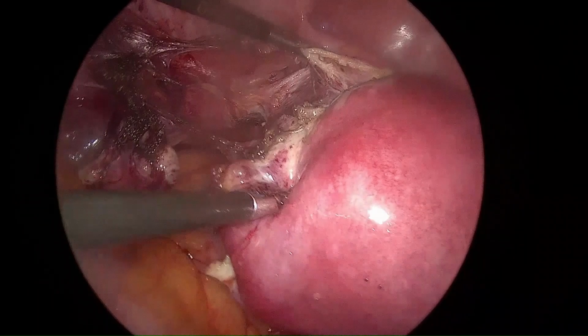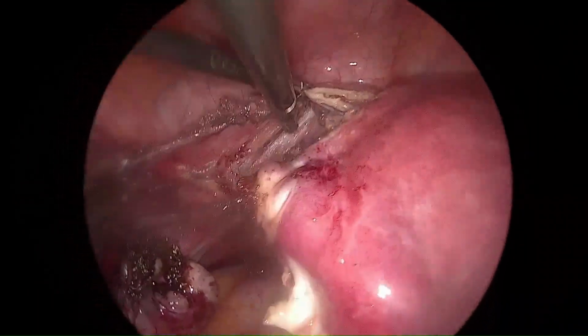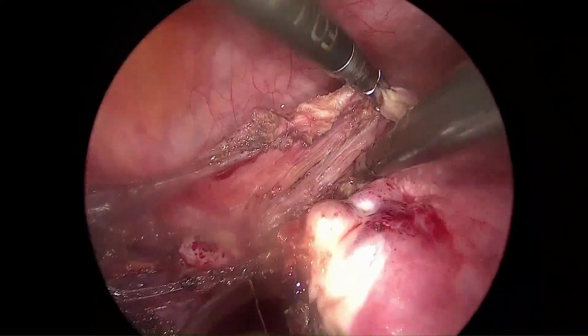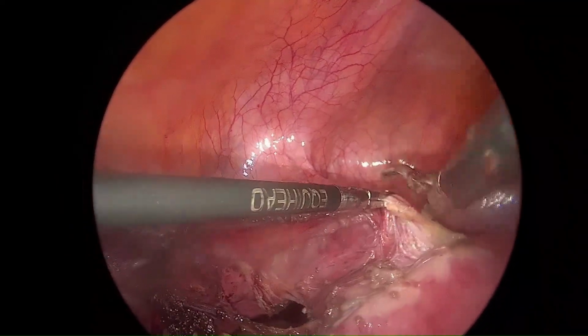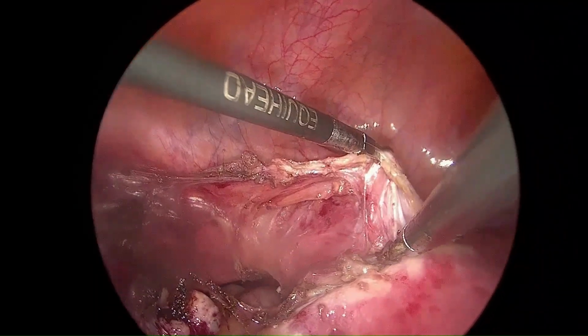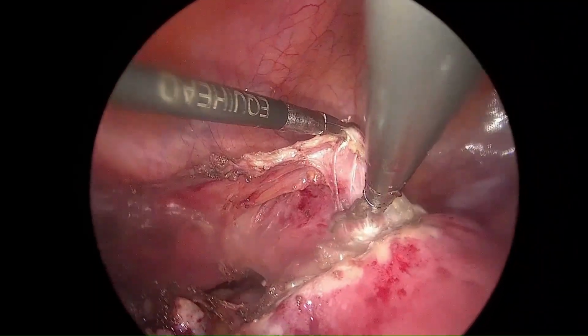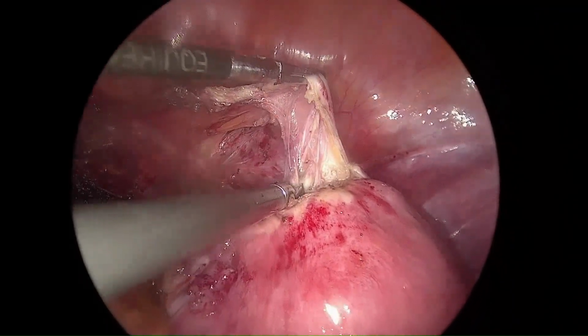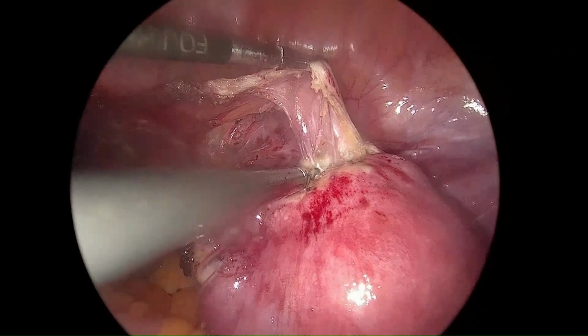The window is widened by shifting the posterior fibers more posteriorly, anterior fibers more anteriorly, and the remnant fibers of the bladder on the cervix, shifting them towards the roof. Repeatedly keep shifting the bladder fibers from the floor of the window towards the roof.